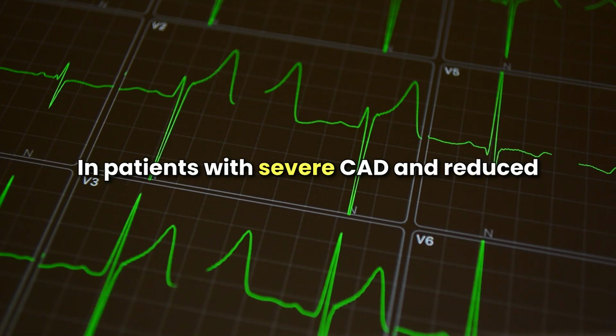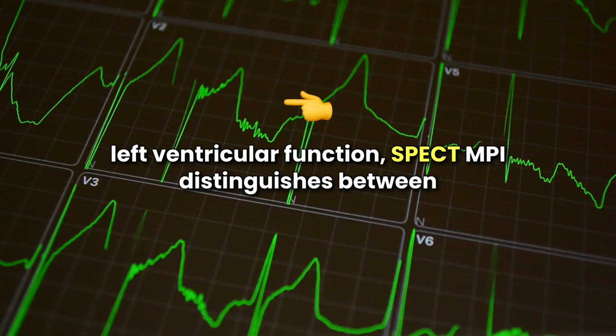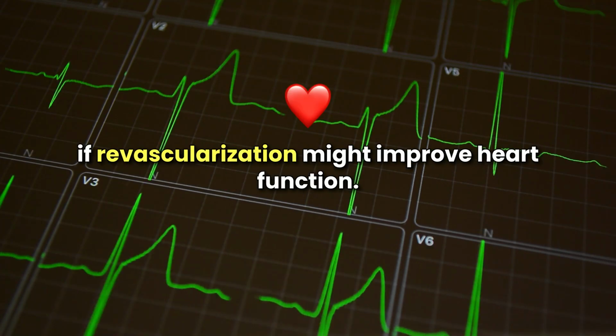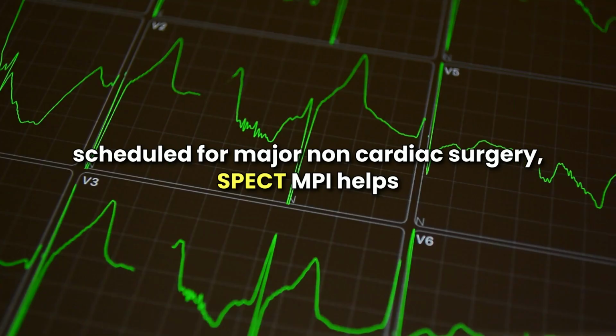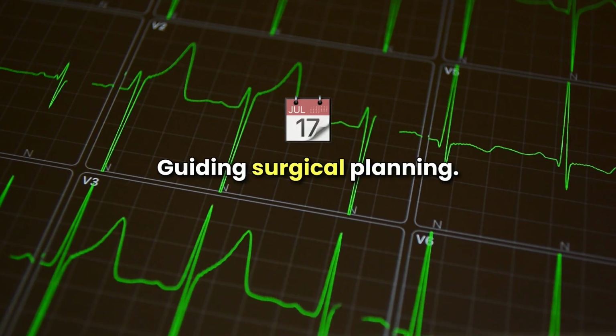In patients with severe CAD and reduced left ventricular function, SPECT MPI distinguishes between viable and non-viable myocardium, helping decide if revascularization might improve heart function. For patients with known or suspected CAD who are scheduled for major non-cardiac surgery, SPECT MPI helps assess the risk of perioperative cardiac events, guiding surgical planning.